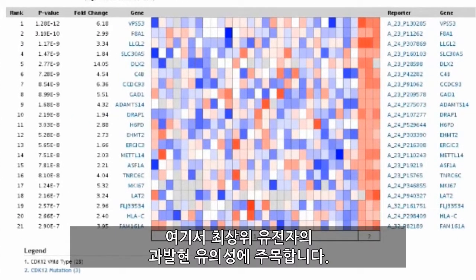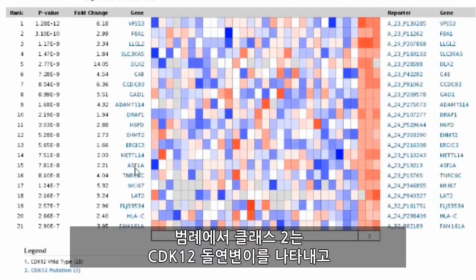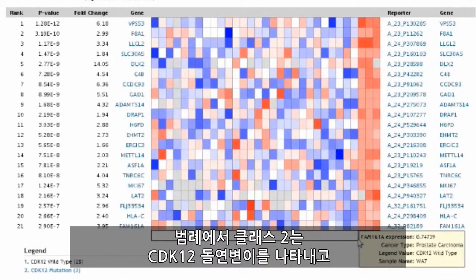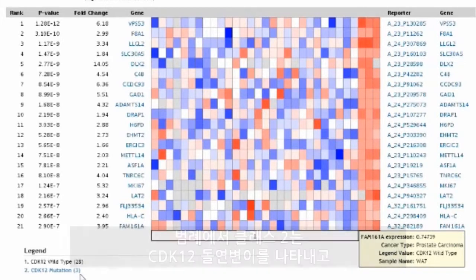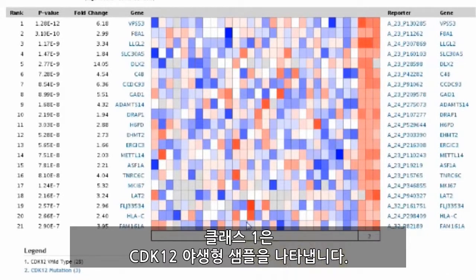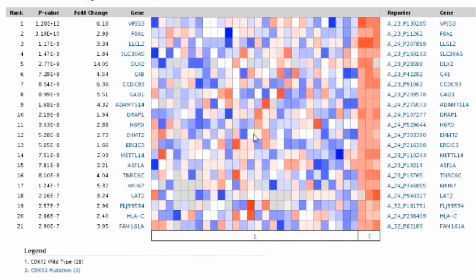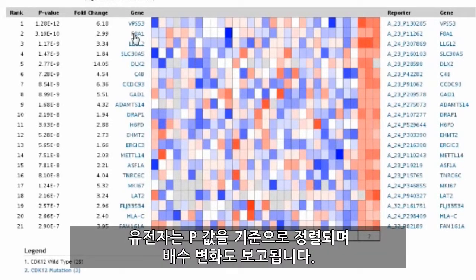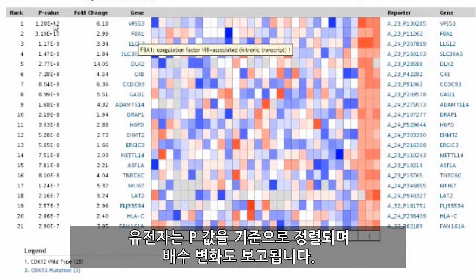Here we note the significance of overexpression in the top-ranked genes. Class 2, shown in the legend, represents the CDK12 mutation, and class 1 represents the CDK12 wild-type samples. Genes are ordered by their p-value, and fold changes are also reported.